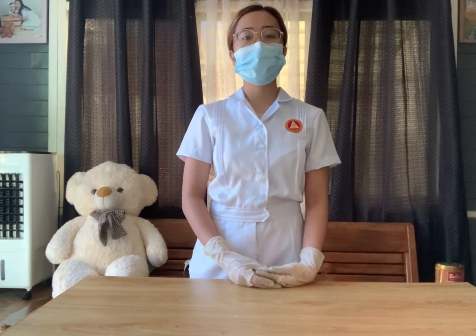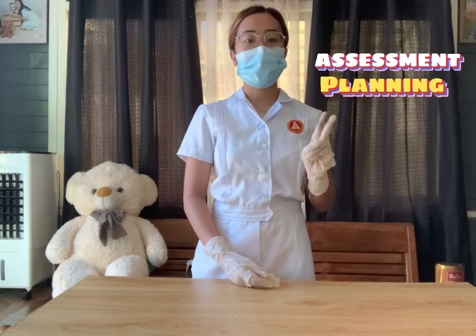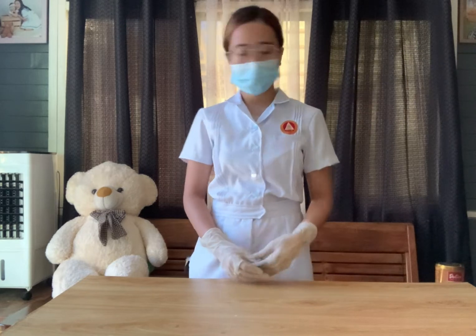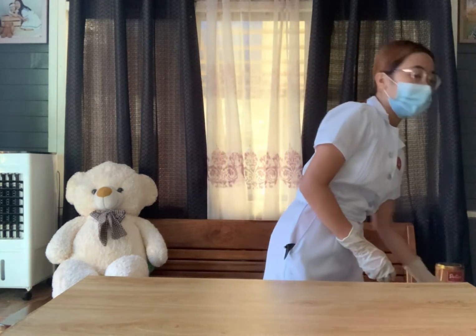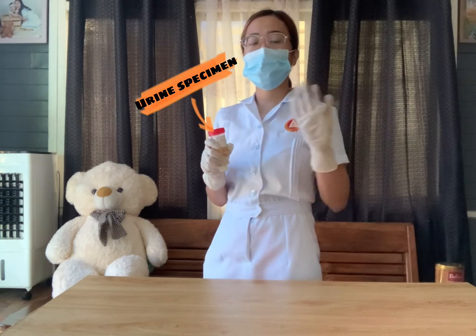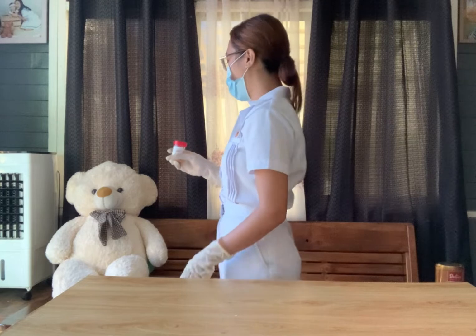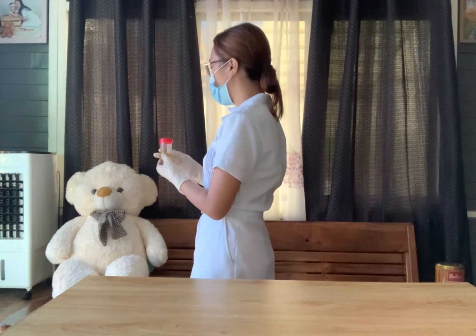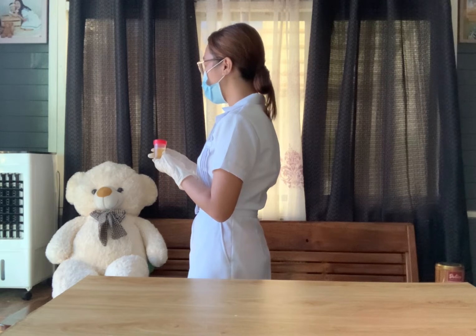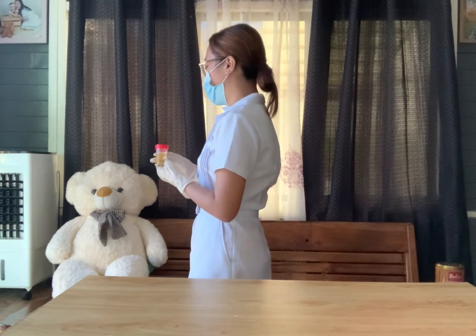This test also needs to undergo steps such as assessment, planning, implementation, and evaluation. For the assessment, you need to assess if the urine specimen was taken before meal, early in the morning, or mid-stream flow. Ma'am, can I ask if you collected this urine early in the morning, before meal, or in mid-stream flow?